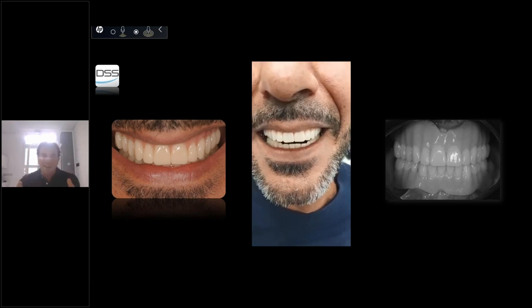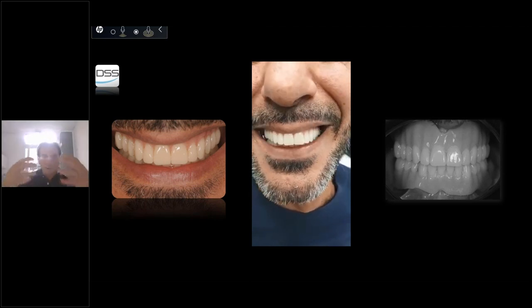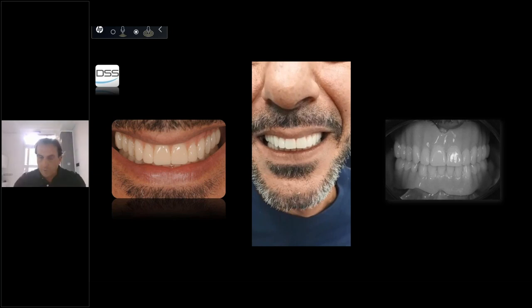I always do a clinical exam. I control the occlusion. I use colored paper to control the number of contacts, but it's so important now to know something more about the muscles. So now I take a new exam in this situation, in this case.